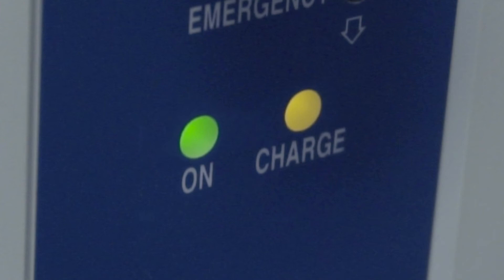If the battery is on the charger and the yellow charge light is off, this indicates the battery is fully charged. The lift will not operate while it is charging.